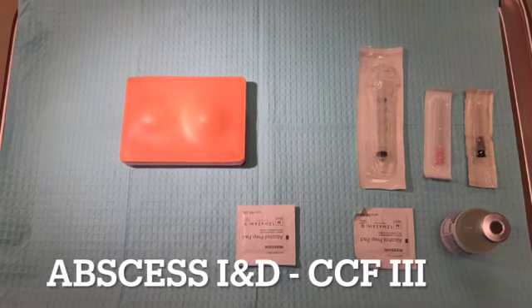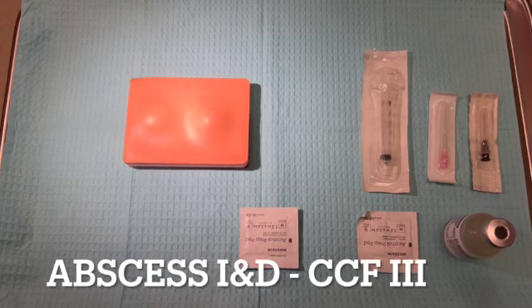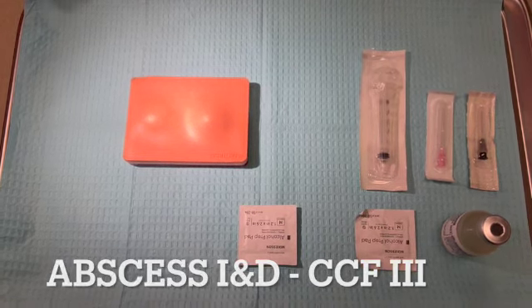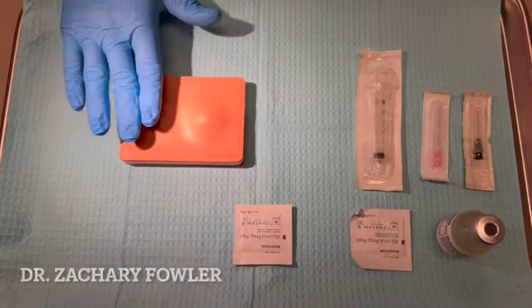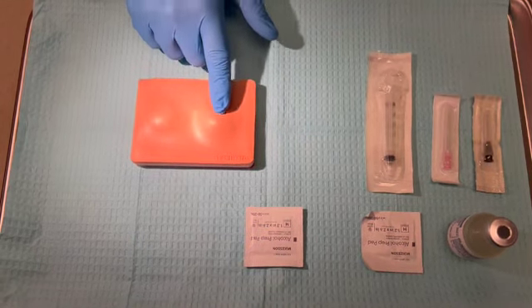Today we're going to review the basic approach for incision and drainage of common skin abscesses. At this point in the examination, we've determined that we are dealing in fact with a common skin abscess. We've gone through our differential diagnosis. We've palpated the area of concern and have determined that this is a fluctuant abscess.